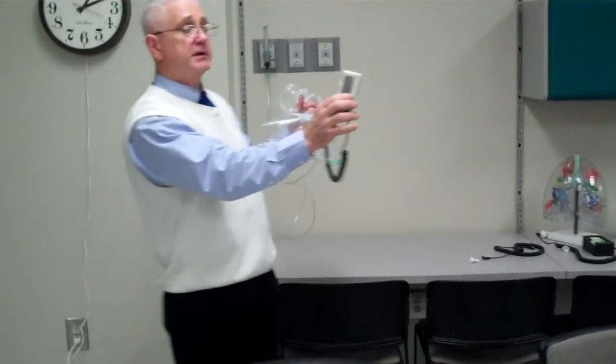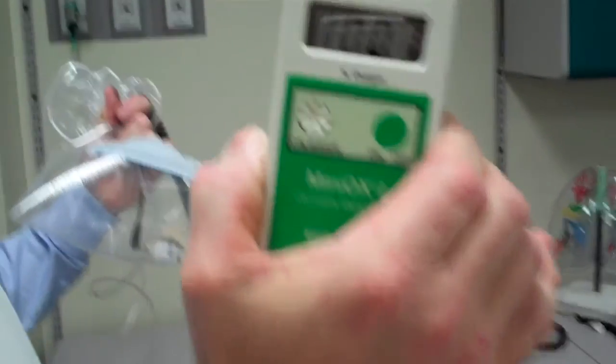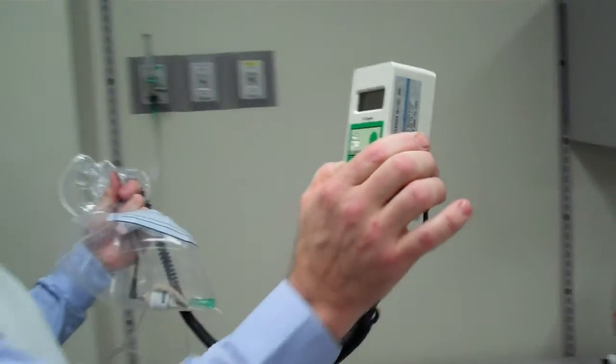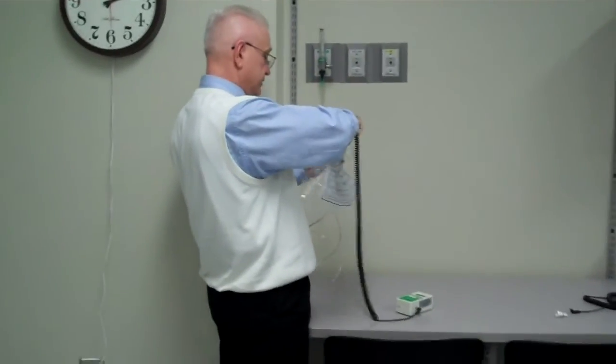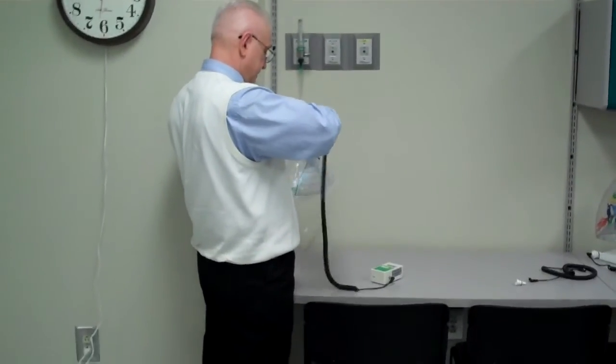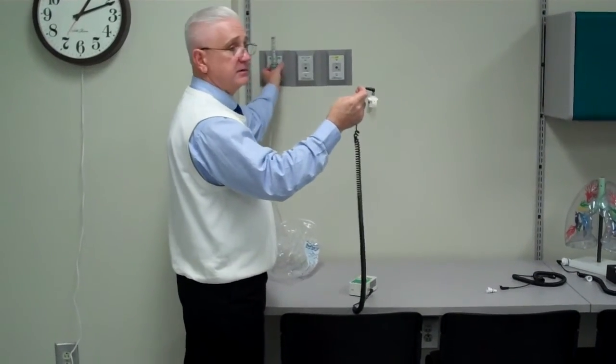You can see that it's saying 100.1. I'm going to set it back down now, and now I'm going to take my fuel cell out and turn off my O2 so as not to waste it.